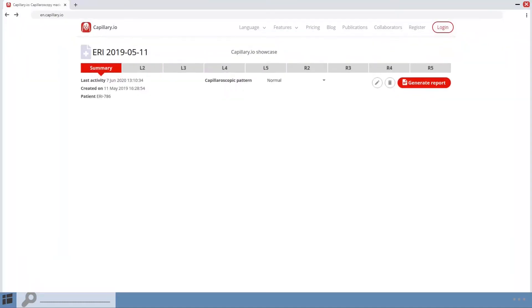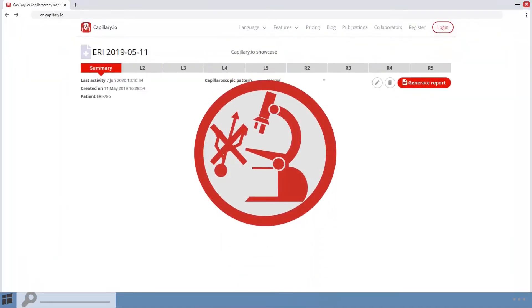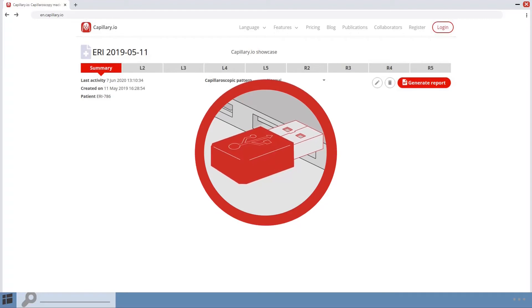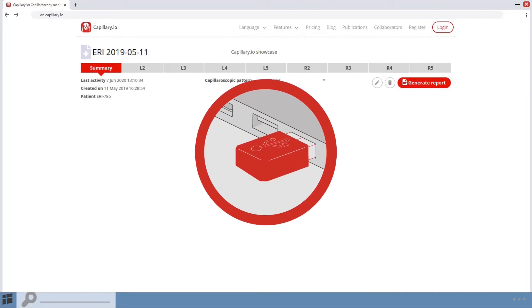In addition, you can upload any other image, for example, imported from a USB stick.